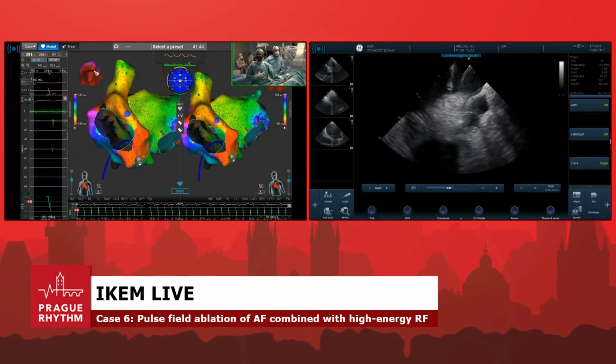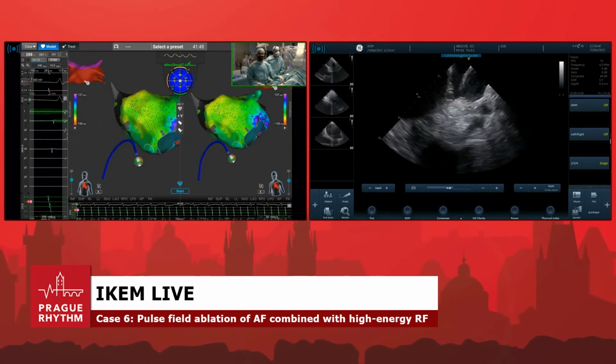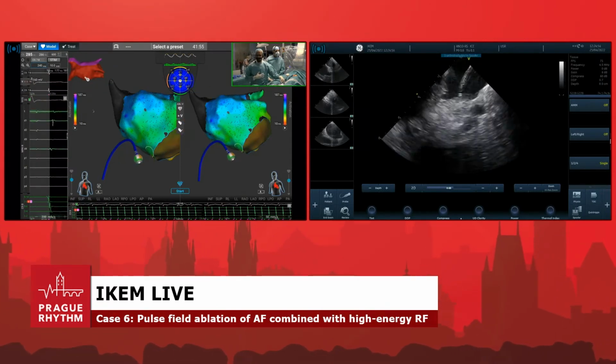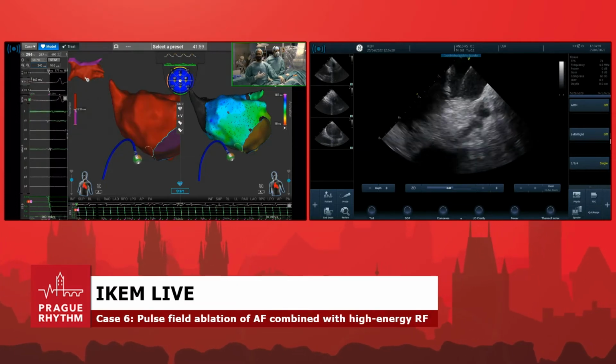Can we increase volume? Can you hear us? Yes. Okay, so let's just see the left atrial map. So while you were watching us, we isolated the right superior vein and we did the posterior wall isolation.